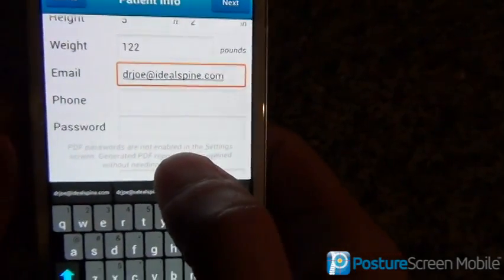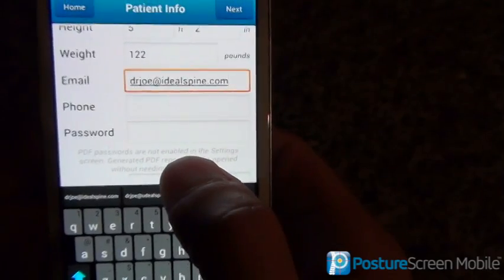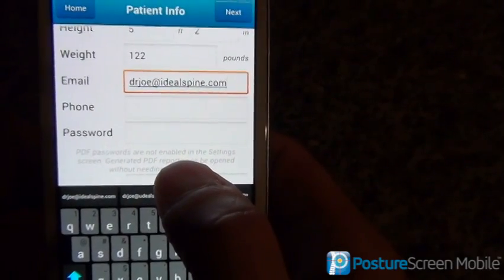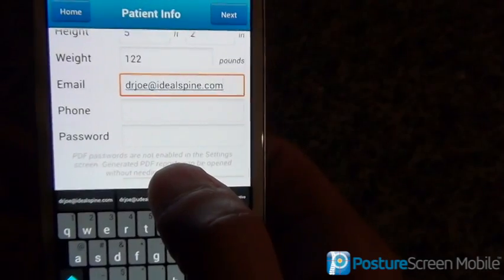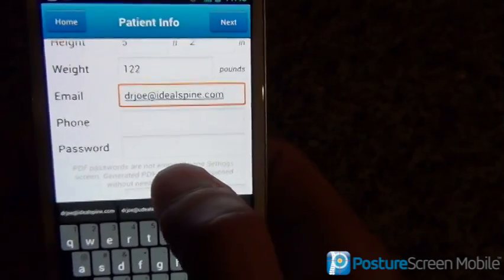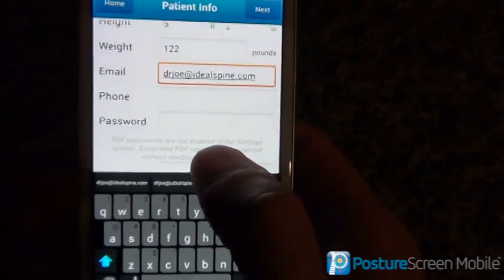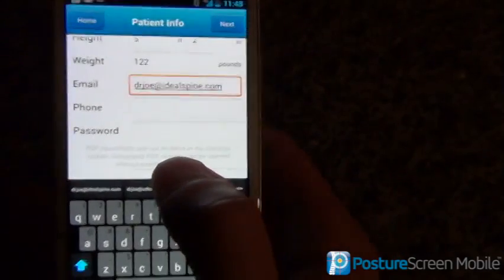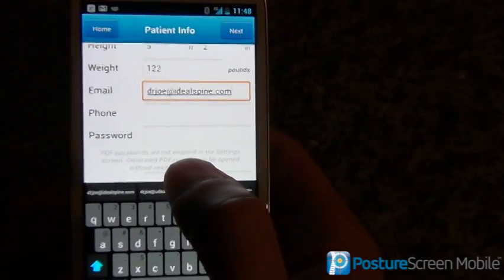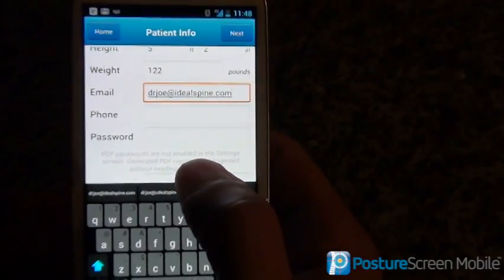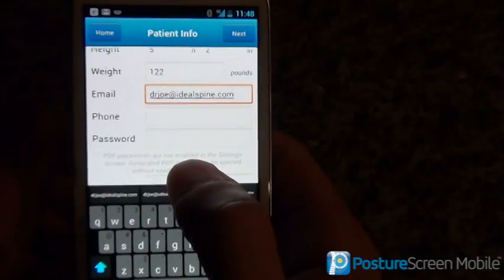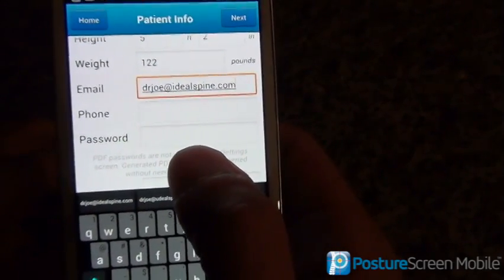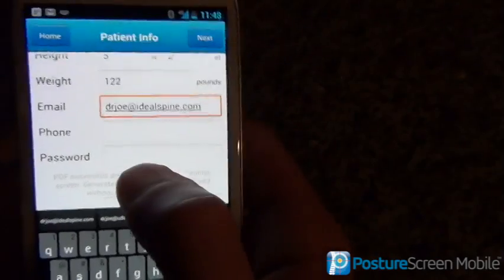This password is for HIPAA compliance for emailing, to make it as secure as possible so only the patient can open it using their password. You might ask the patient their dog's name or what password they want, or just make it simple — whatever you decide with the patient. They're going to have to remember it to open up that PDF document.